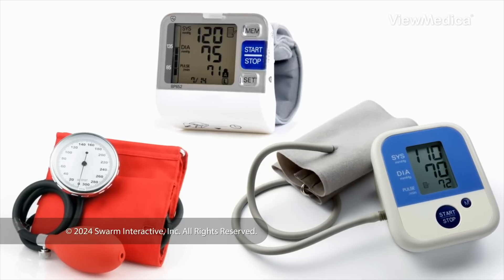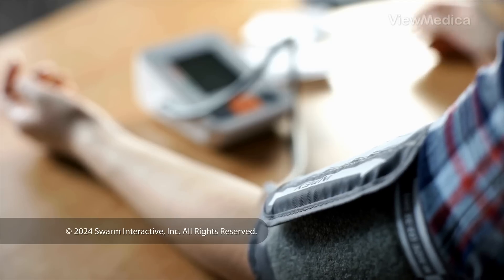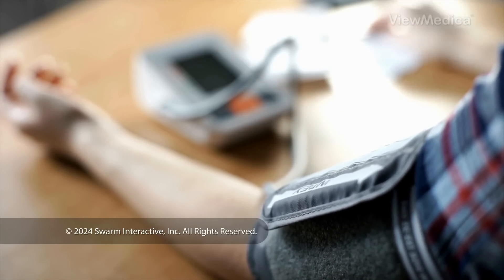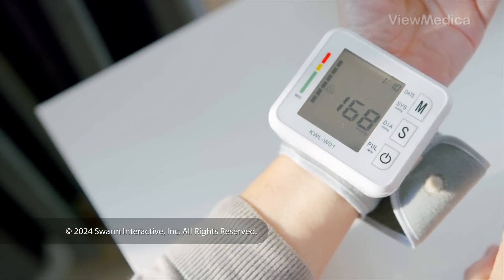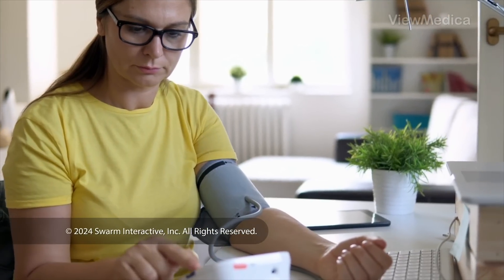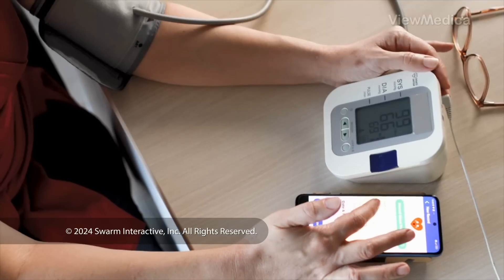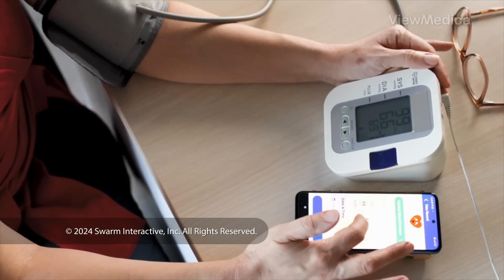First, choose the right device. Your best bet is to find one that has an upper arm cuff that fits your arm. Upper arm cuffs tend to give better readings than wrist cuff devices. And to make things as easy as possible, consider getting a device that automatically stores your readings either in the device itself or in a separate smartphone app. Some will even transmit this data to your doctor.